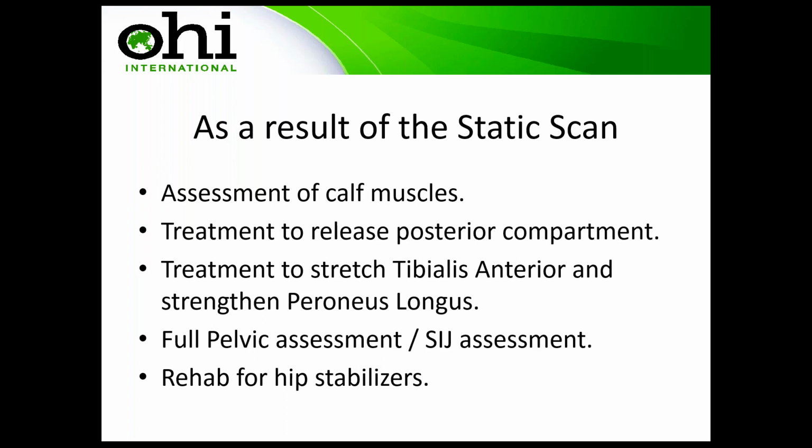And everything that you do will help down the line, especially if you're going to go down the route of treating this patient long term, or if they do move into a pair of orthotics. Everything that's done here will help the orthotic to be effective.